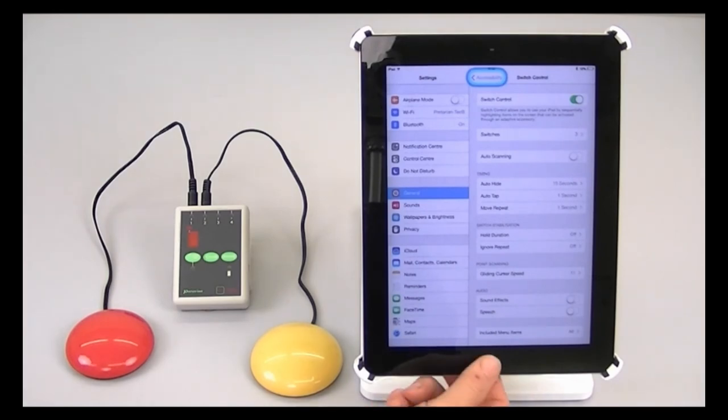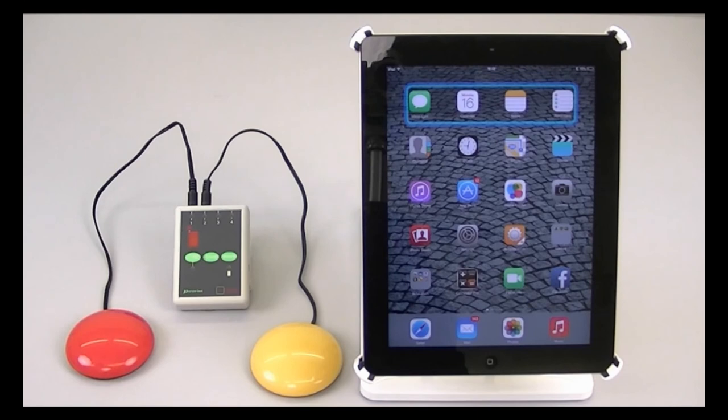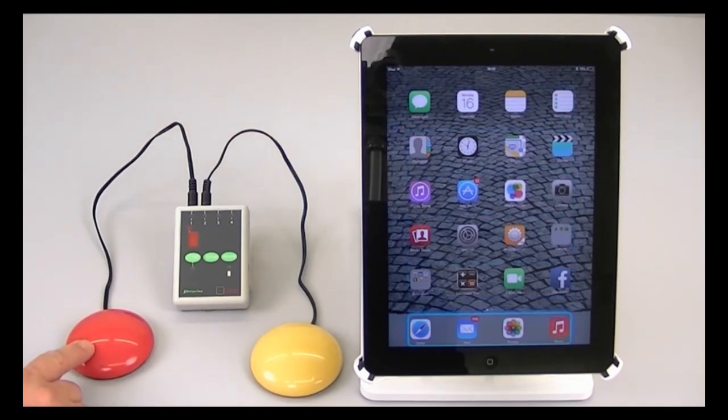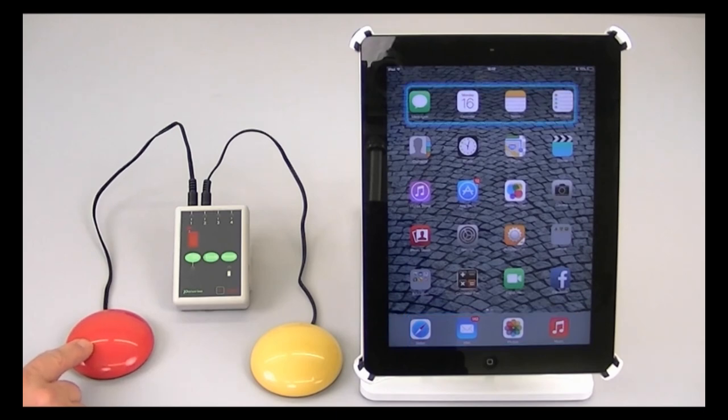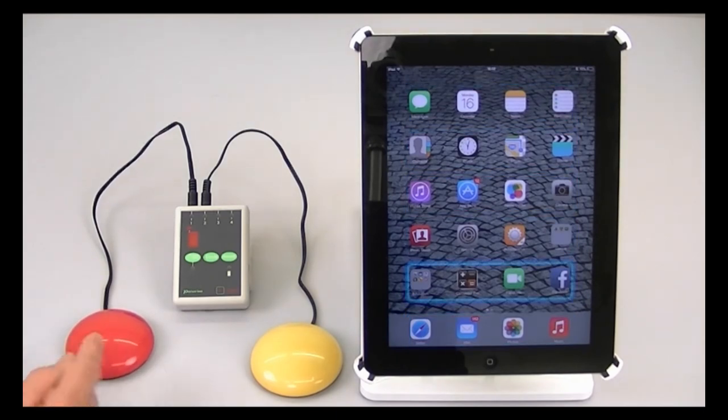If I now press the home button, then I'm back on the home screen, and you'll immediately see the highlight appear around the first row. And I can manually scan forward, back up to the top once I get to the bottom, and I can select any item.